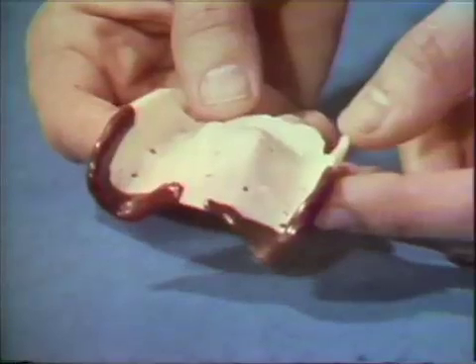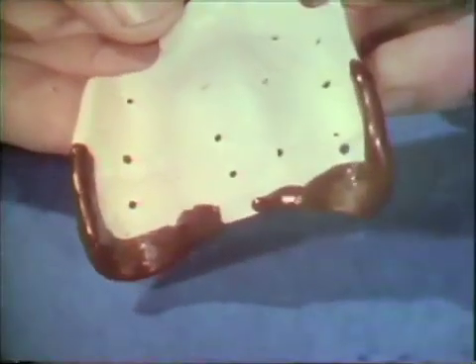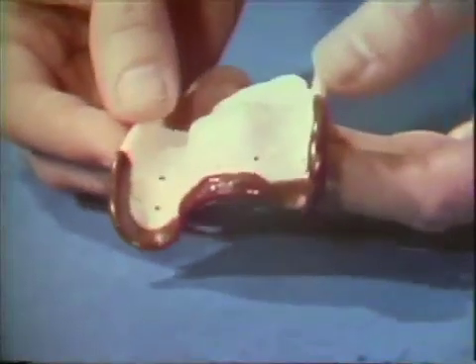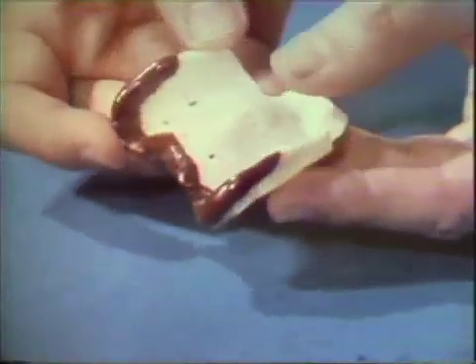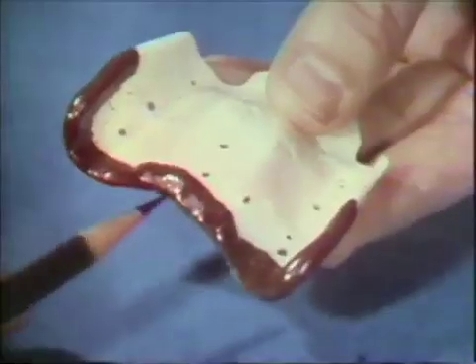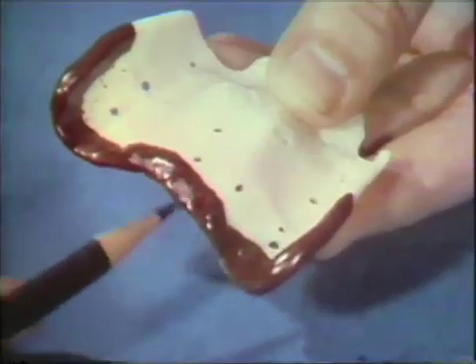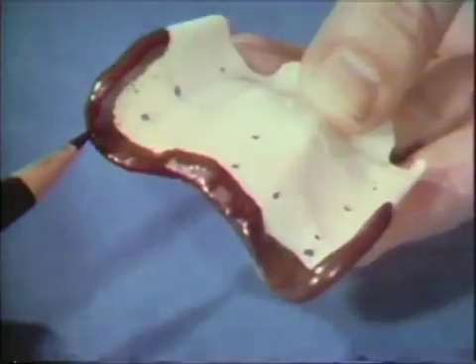When this is satisfactorily accomplished, the posterior border is refined. This border should be placed at the junction of the movable and non-movable tissues. The border molding is continued across the midline of the palate. This does not automatically determine the exact distal extension of the denture. By looking at the anatomic structures on the compound and locating the fovea palatinae and the hamular notches, a line is drawn through these landmarks with an indelible pencil.